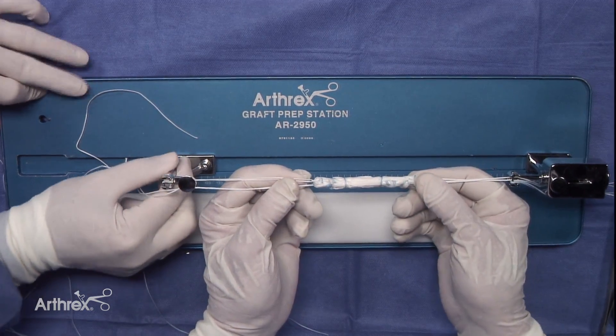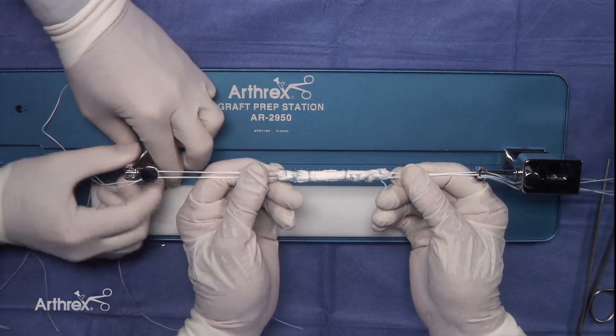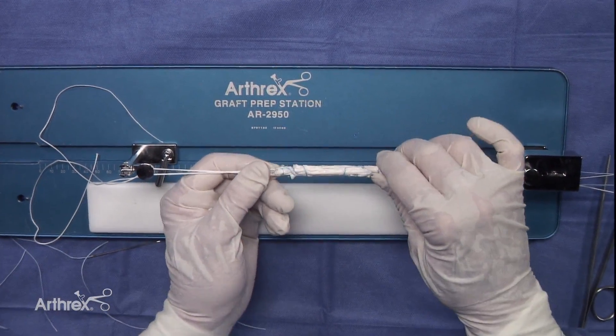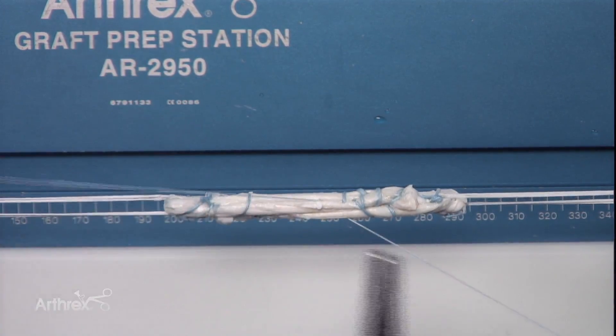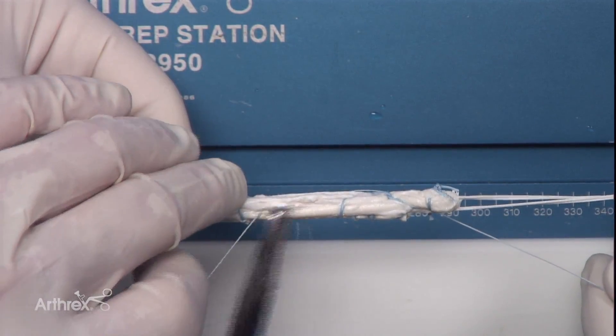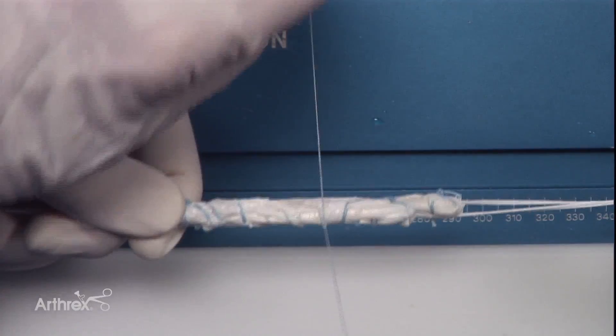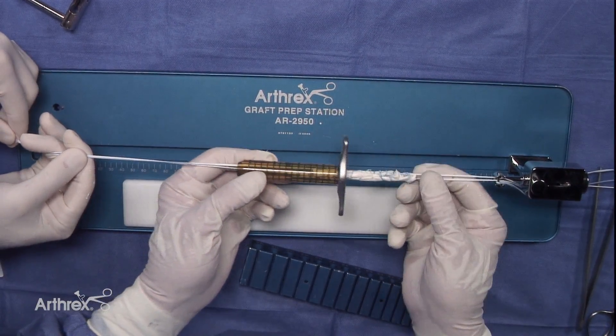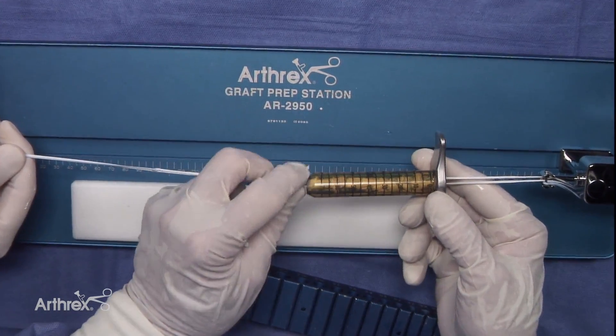Now we're going to put it under 40 newtons to precondition it. Then we have a final suture to put in. I like to put a whip stitch that brings all the fibers together. We're putting it together as a major collagen construct. We have a graft tube. This is a nine millimeter graft tube, and that fits over it very nicely. Compresses the graft, compresses all the sutures.